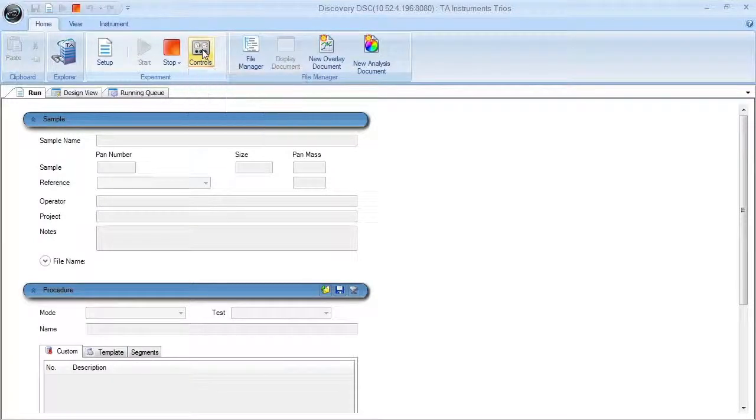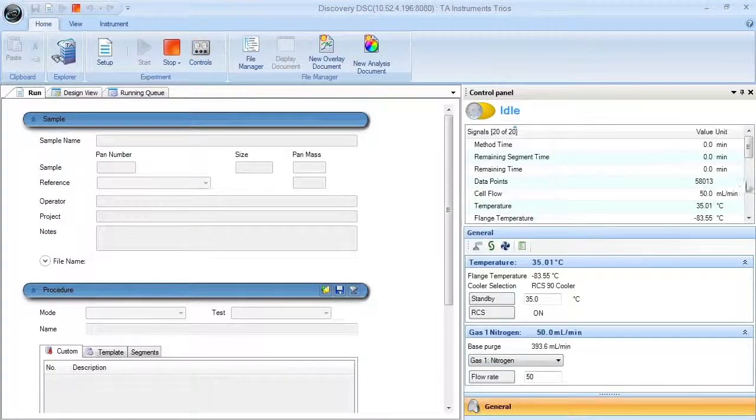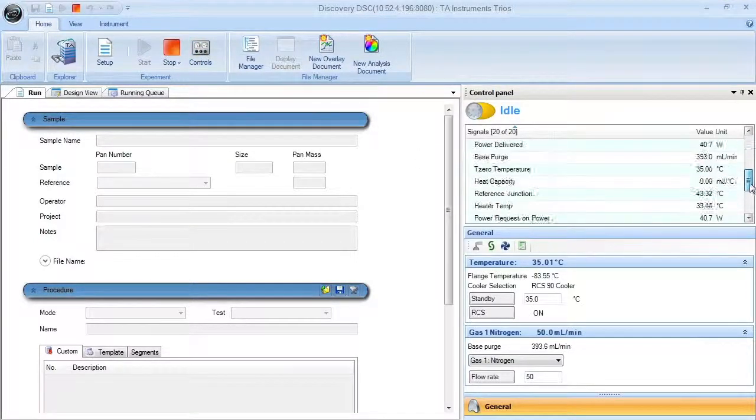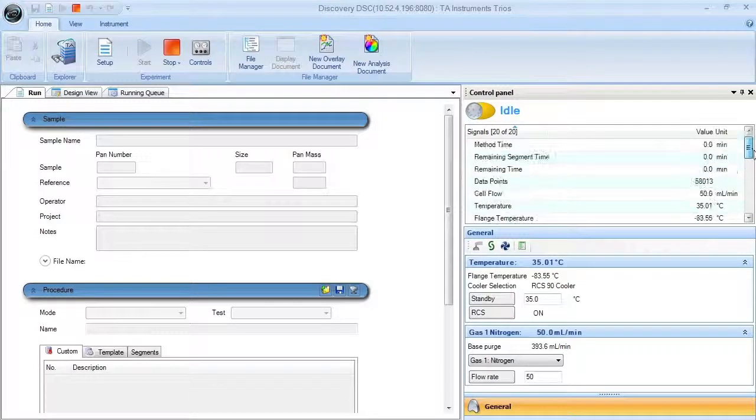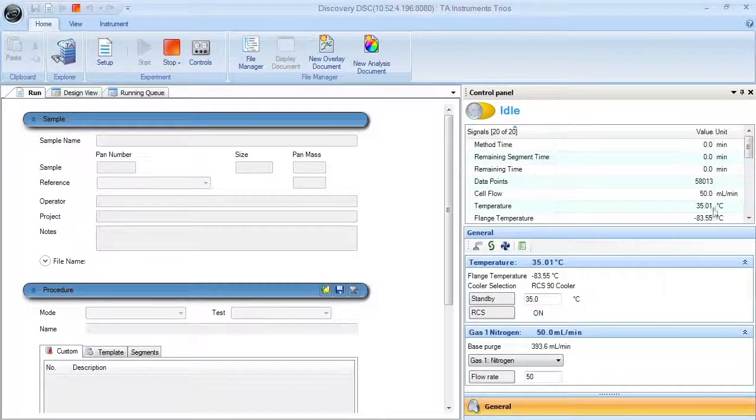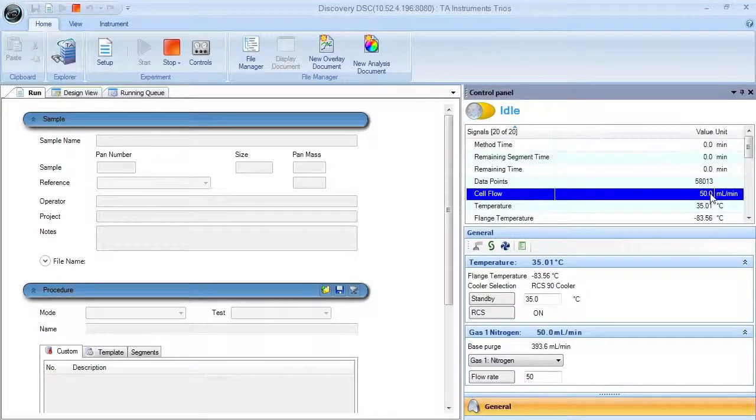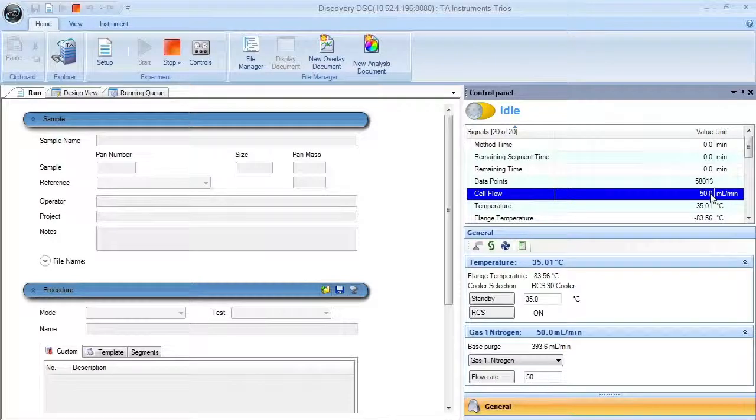The control panel allows you to monitor real-time signals such as temperature, time, and gas flow rate. The gas flow rate is controlled by an internal mass flow controller.